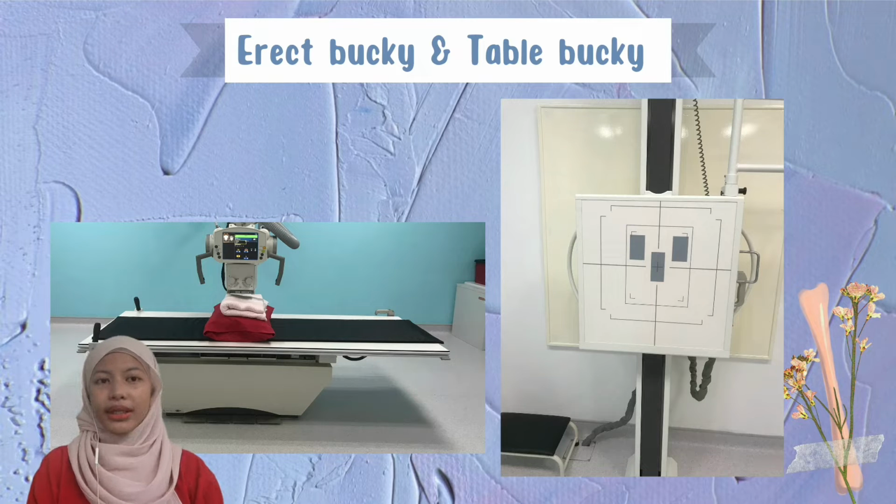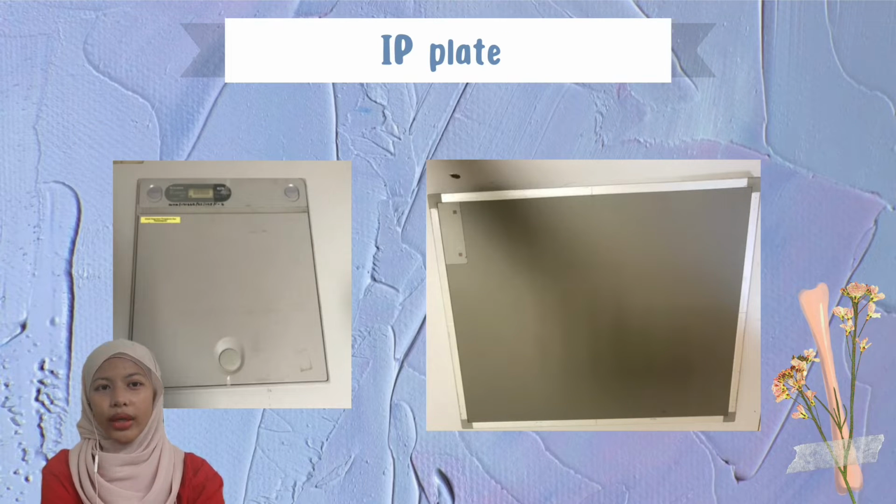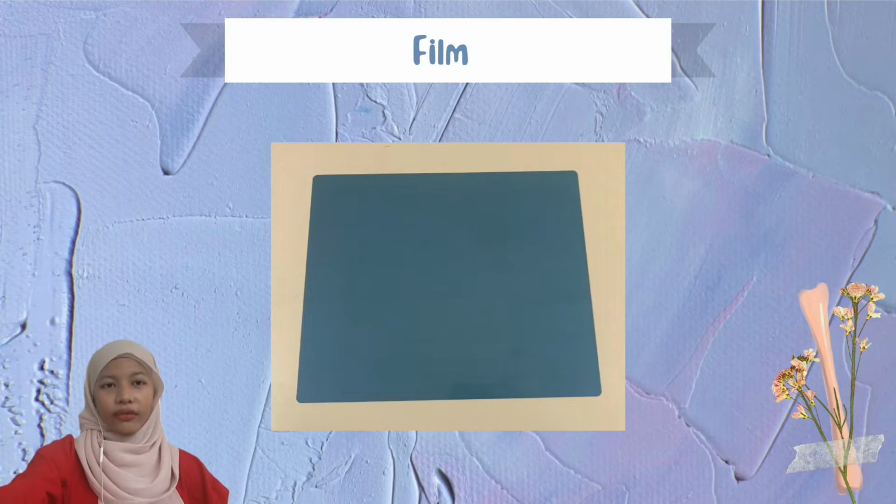But when the patient has no ability to stand or sit, the patient can do their projection at the table bucky, lying down. The cassette holder is a device that fixes or supports the position of an X-ray film during an X-ray exposure. The IP plate is the one that will record the result of the radiation. The film plays a role in displaying the radiographic image.